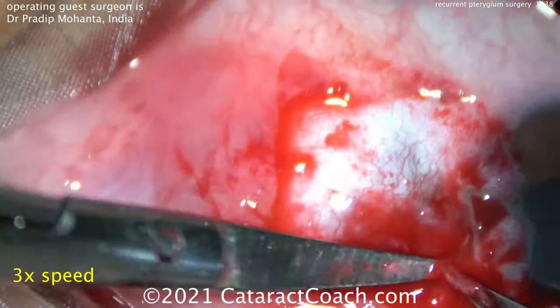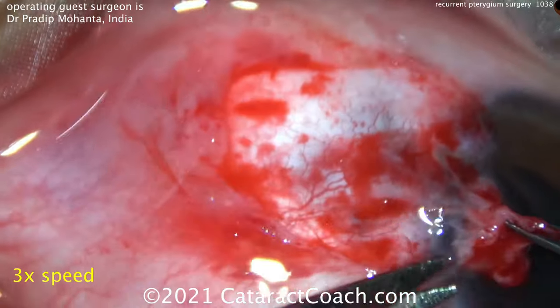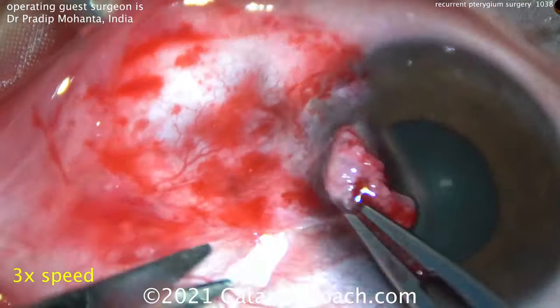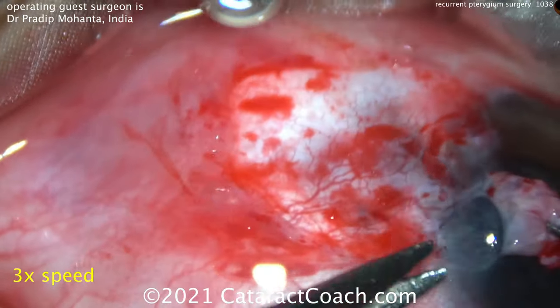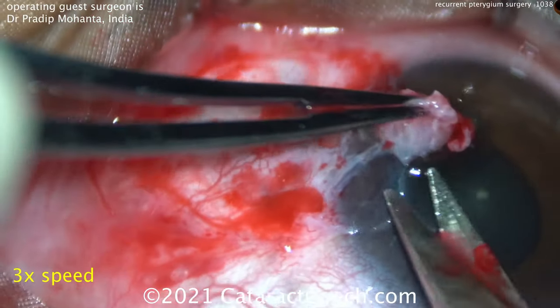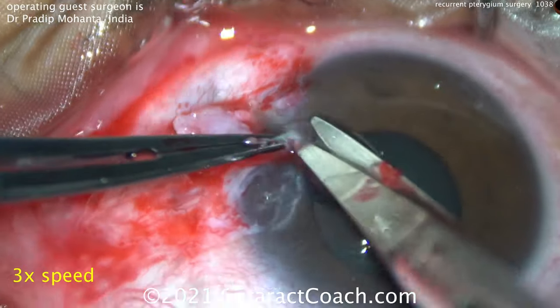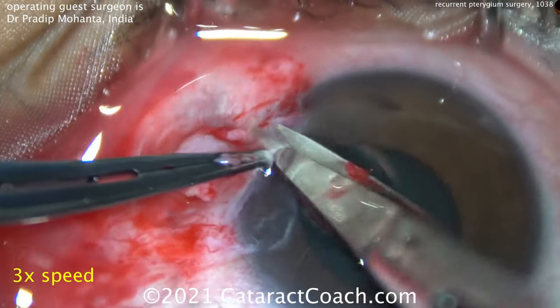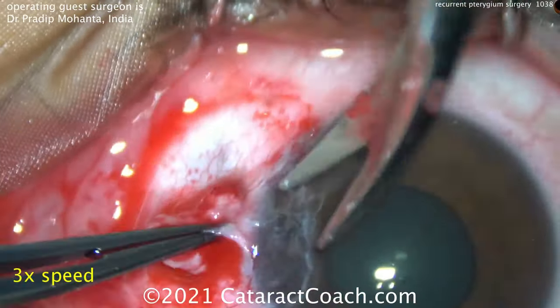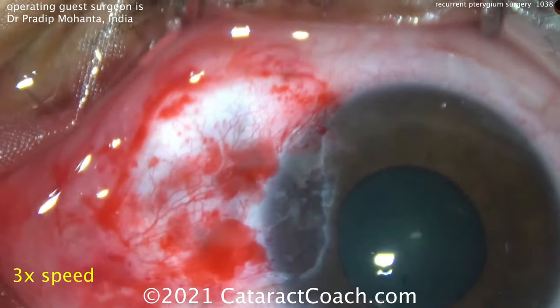You want to dissect very carefully on this plane — don't enter into the corneal stroma at all. You really have to take your time and get a good plane. A master surgeon like Dr. Mohanta takes about 15 minutes for this surgery; we sped it up, so it may take you 20 or 30 minutes — that's okay, be patient. Now you see the rest of that Tenon's carefully removed; the cornea is not damaged at all.